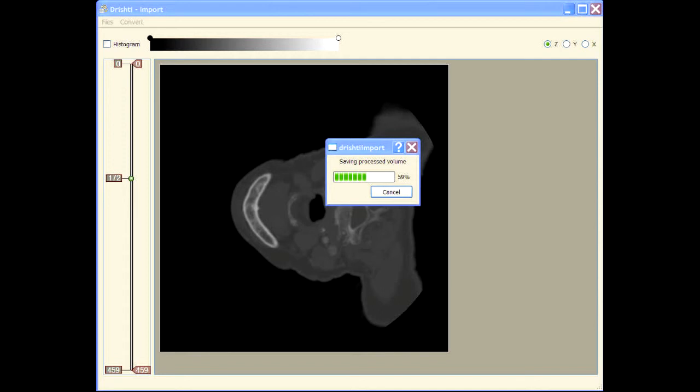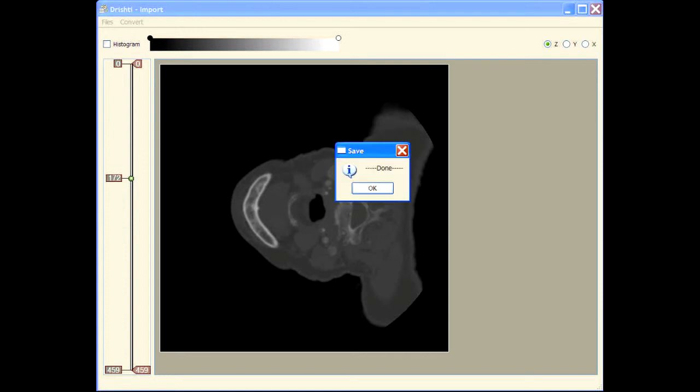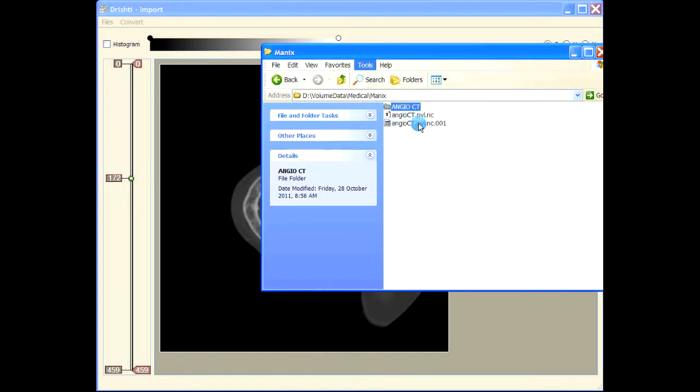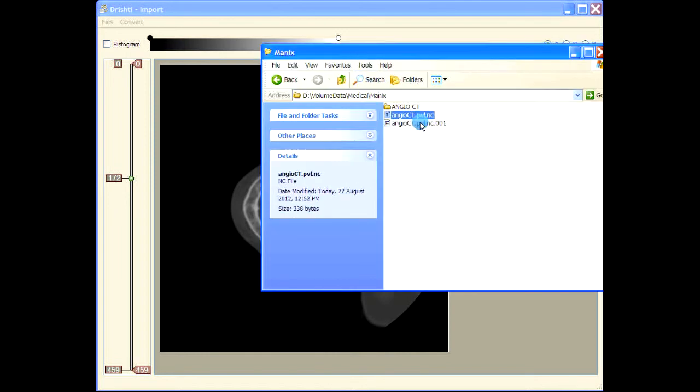Now if your data is more than one gigabyte, then the data is split into multiple files, each file no more than one gigabyte. This is done in order to make the transfer between 32-bit and 64-bit systems easier.